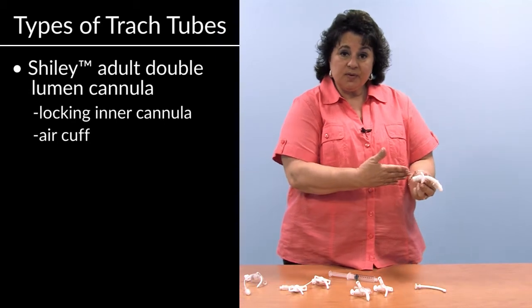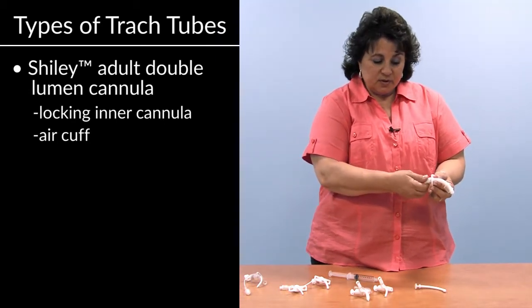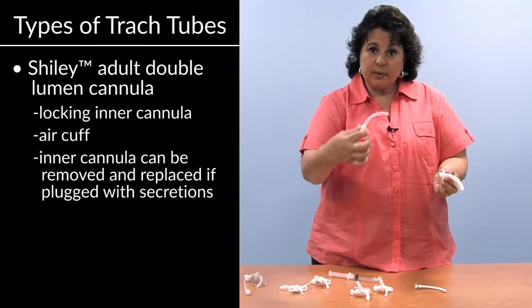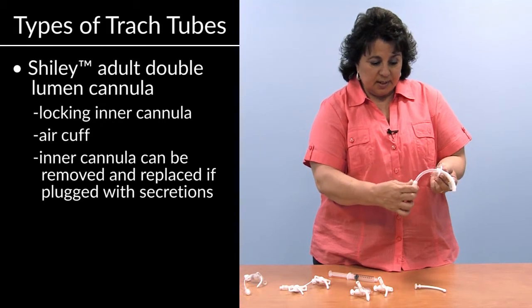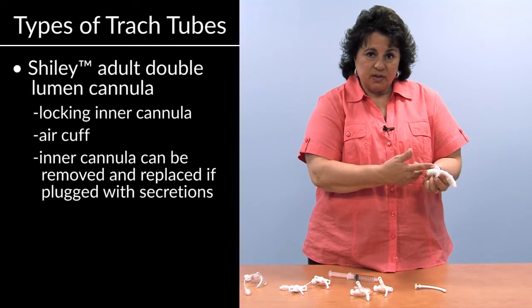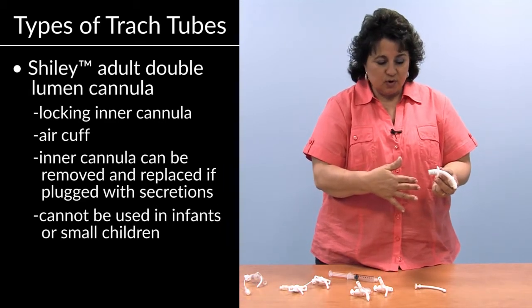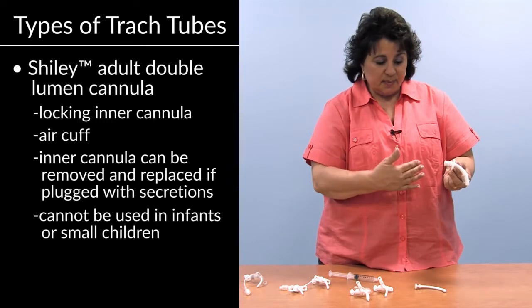When the tube is in use in a patient, if the tracheostomy tube becomes plugged with secretions, you can take the inner cannula out and remove the plug, thereby allowing the patient to breathe, replacing the inner cannula with another one, or cleaning this quickly and putting it back in place. That is the major advantage of the adult Shiley double lumen tracheostomy tube. The sizing doesn't allow it to be used with infants and small children. It's available only in a 5 inner diameter and up size.